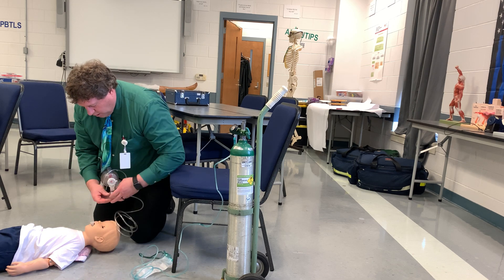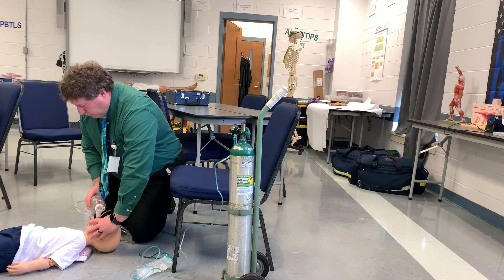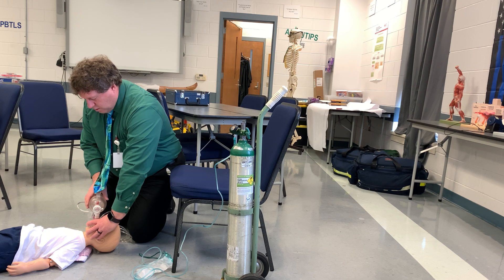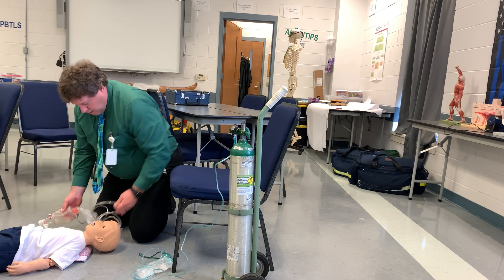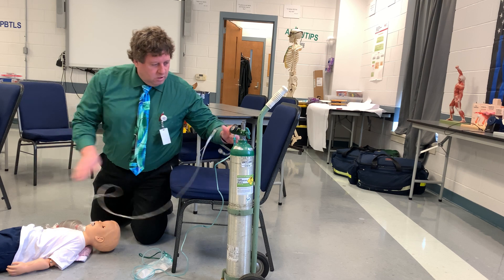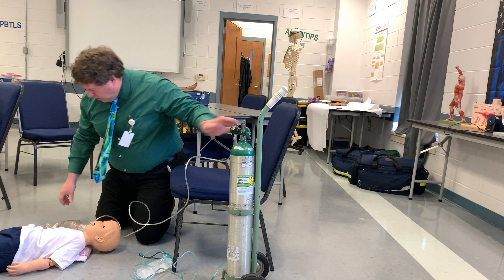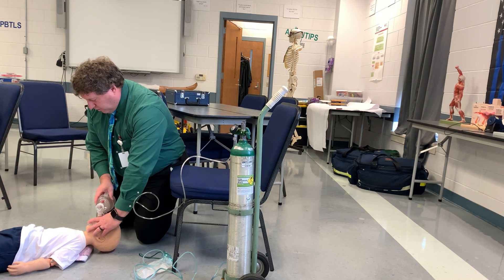At this point, we'll begin ventilating the patient. Remember with children who have a pulse, we give one breath every three to five seconds. I'll let my partner do that for just a moment as I connect this to oxygen at 15 liters per minute, then come back and continue to ventilate the patient — one breath every three to five seconds.